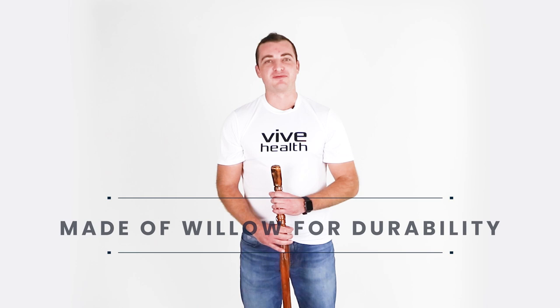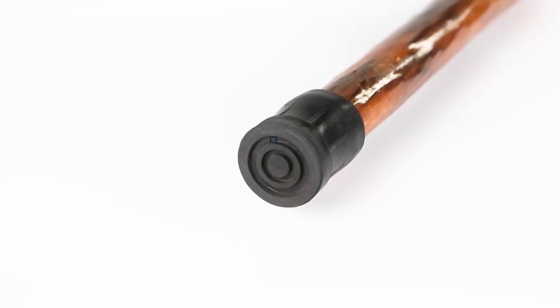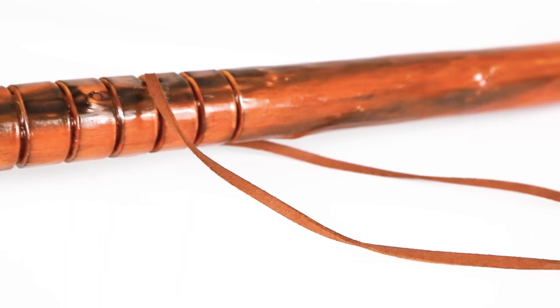Each lightweight walking staff is free formed with a single piece of willow to create a durable wood cane. It's capped with a large non-slip rubber tip to provide greater traction on smooth surfaces and a loop to secure it to your wrist.